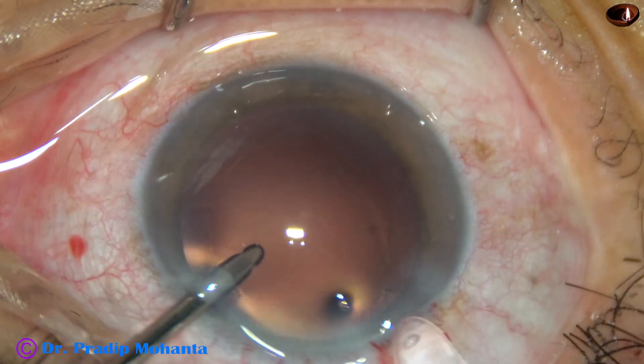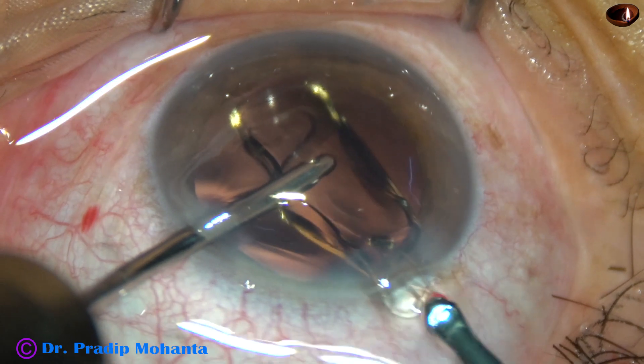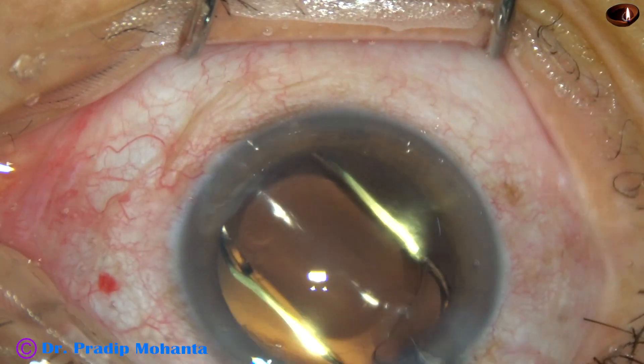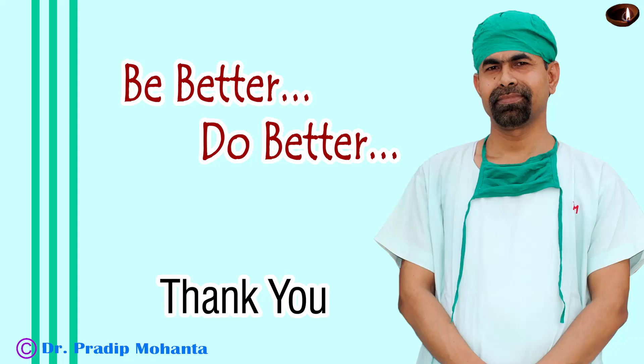In all these cases, the sideport on the left side was used only for hydro-implantation of the single-piece monofocal intraocular lenses. So, it is very much possible to do soft cataracts without using a chopper. Thank you very much for your attention. Hope this video will inspire you to try new things.